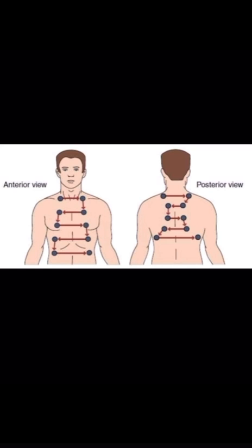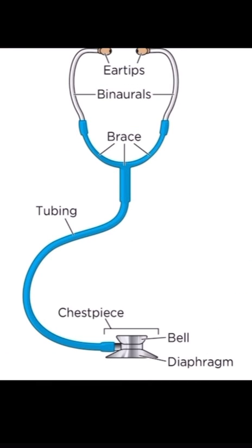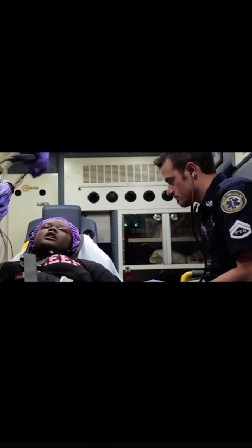On auscultation, start with the apex, then work your way in a zigzag motion, comparing each side until you reach the base, front and back. When using the stethoscope, the diaphragm is commonly used for breath sounds, and the bell is used for heart sounds. Breath sounds.